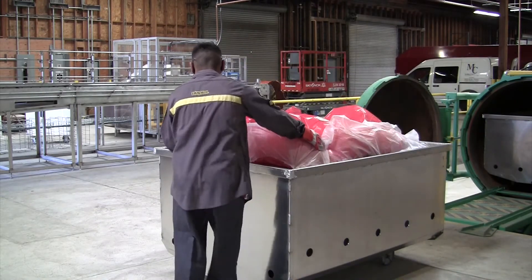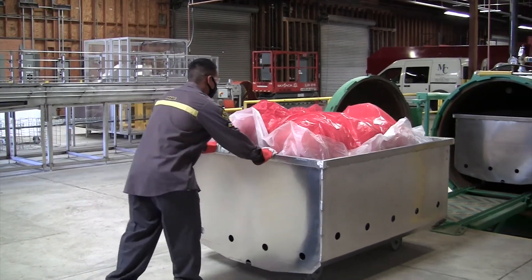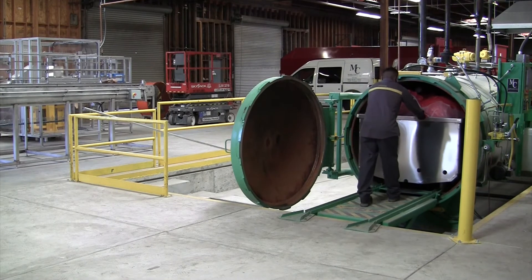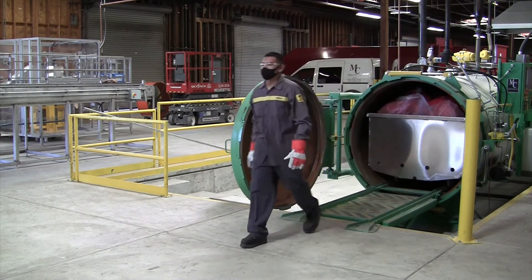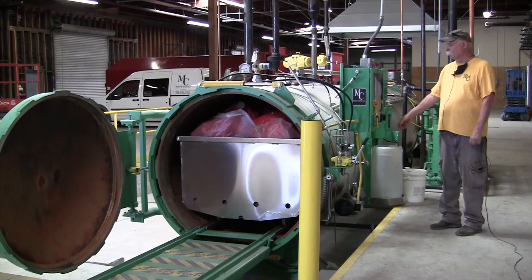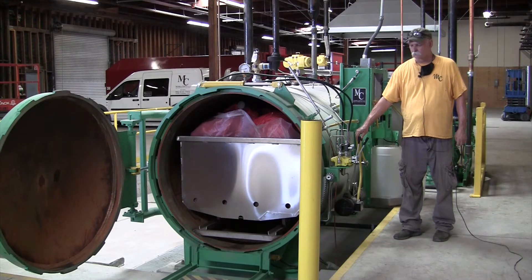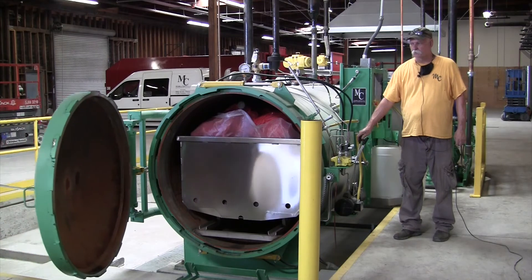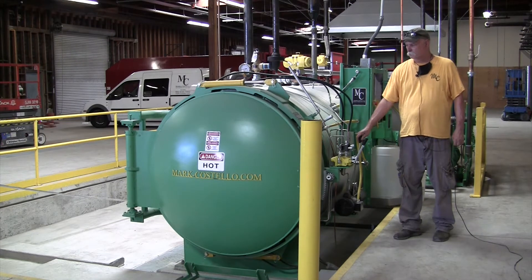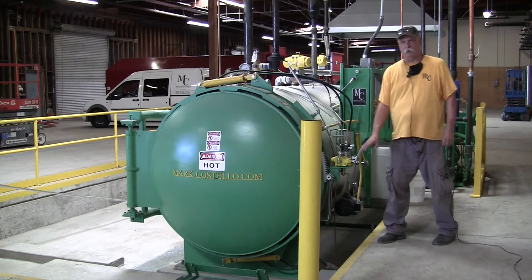Once he is satisfied that everything is in place, he's going to push it in. You can see there's a cart already inside the sterilizer — that cart is fully processed along with others in there. When he pushes this cart in, it's going to push all the carts through one at a time. He will repeat this process until he's got all the processed carts out and all the new carts in, then close the door. Once your last cart is loaded, start your hydraulics, lower the lift by pushing up to lower, push the center handle up to close the door, then push the last handle up to close the ring. Once it's done, close the handle — that will shut off the hydraulics pump.